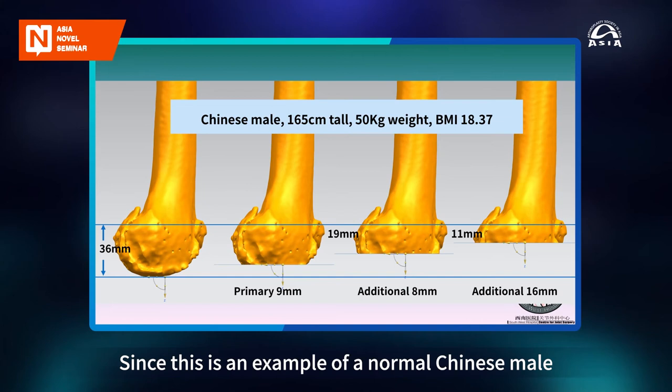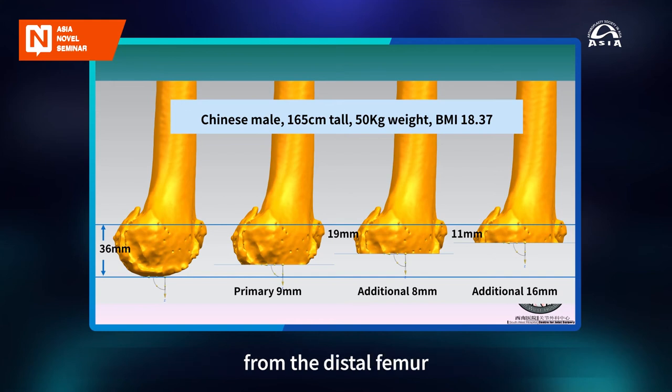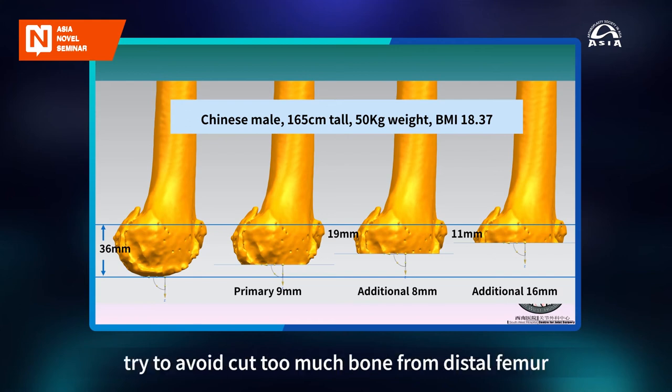Since this is an example of a normal Chinese male, if we remove more than 14 millimeters from the distal femur, we have very little bone posteriorly to hold the femur component. So I think we all agree that we cannot remove too much bone from the distal femur, for the goodness of the fixation and for the joint line. Maybe we should do more soft tissue release posteriorly, and try to avoid cutting too much bone from the distal femur.